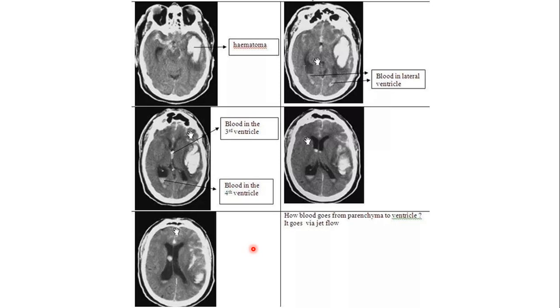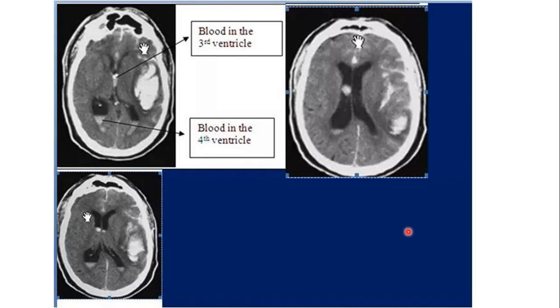The blood goes from the brain parenchyma to the ventricle by jet flow — arterial bleeding results in jet flow into the ventricle. Another example shows blood in the occipital horns of the lateral ventricle with a hematocrit level due to sedimentation of red blood cells, also seen at the third ventricle and in the subarachnoid spaces overlying the left cerebral hemisphere, with the intraparenchymal component surrounded by edema.